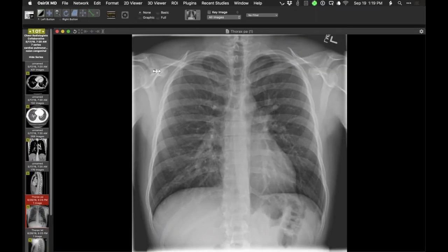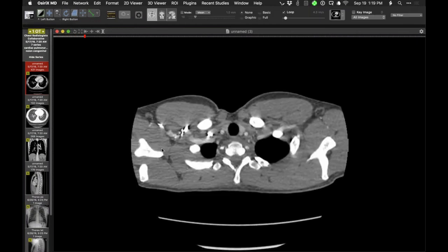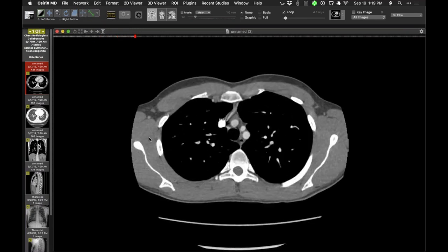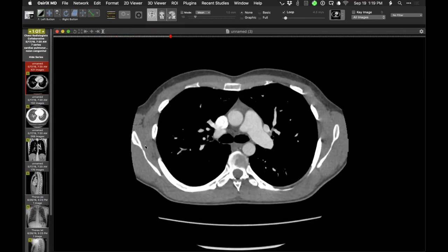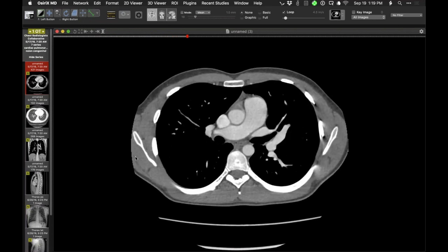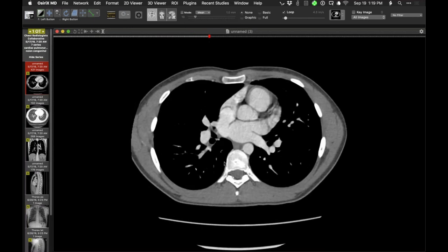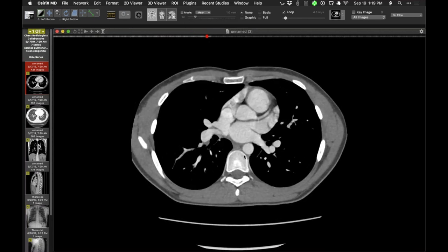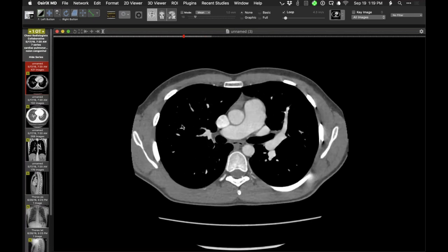And then we typically teach that if you have a shunt, the most common is atrial septal defect compared to, if it's intrathoracic, other things like a PDA or a VSD. And of course, of the ASDs, the most common is the secundum, but less common, you start to look. And I always teach my residents, if you're not sure, look very carefully at the pulmonary veins and make sure that all the pulmonary veins go to the right place. And that is the case here, except for on the right side.